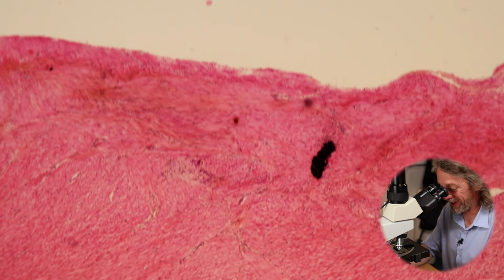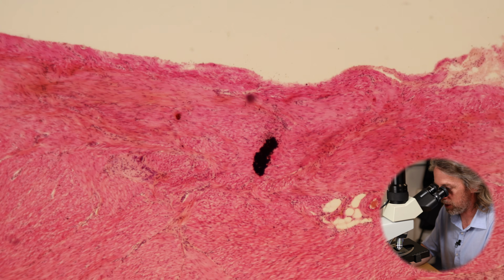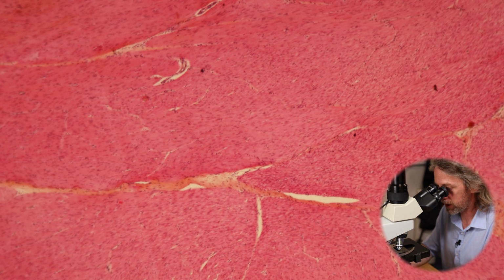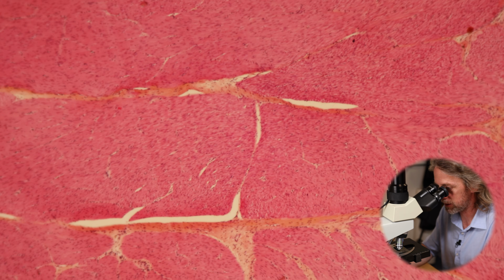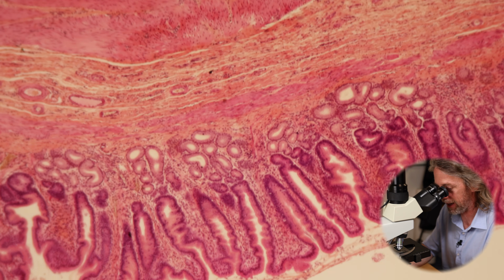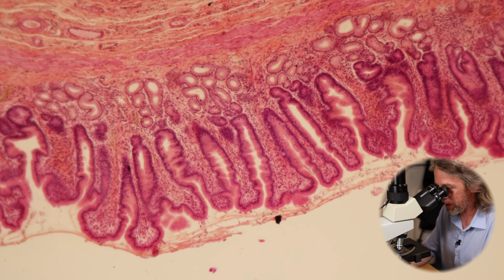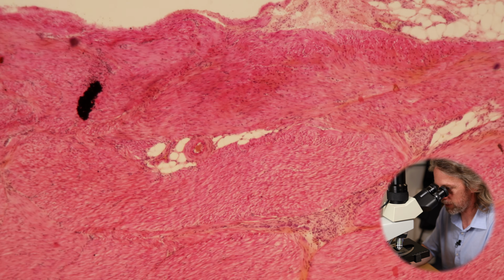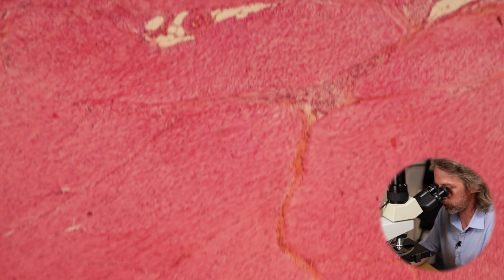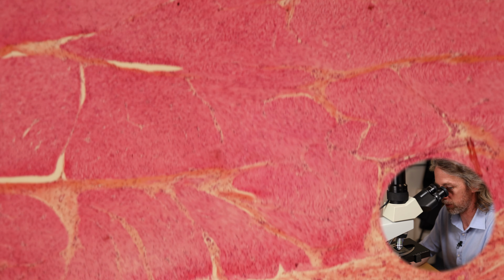But look at this, this is still the lowest power. Look at all this muscle, and it's all in blocks. They're all running in an organised fashion, in slightly different directions, but that's all muscle. And then that last bit here, there's the epithelium. So that's so much muscle. These are the muscle layers, by the way, called the muscularis externa.